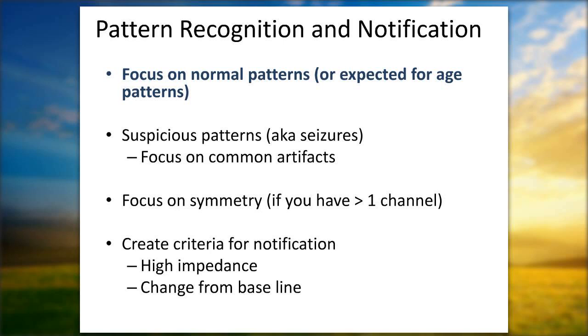There's also always the chance that there may be some unidentified artifact that makes the pattern look more normal. And then I worry about those kids that end up crashing or turning into a worse clinical scenario around 8 or 10, 12 hours, and now we've not cooled, and now they're in status.